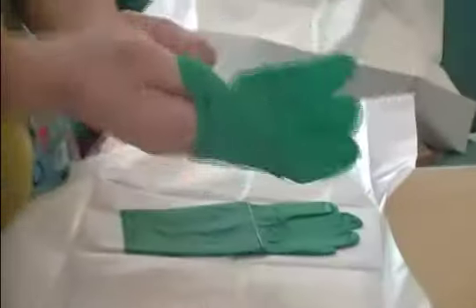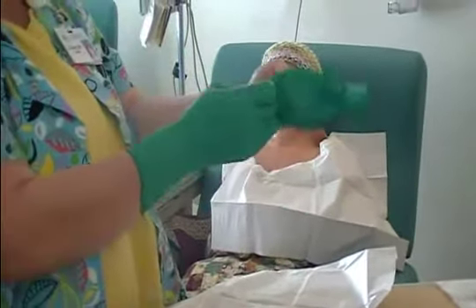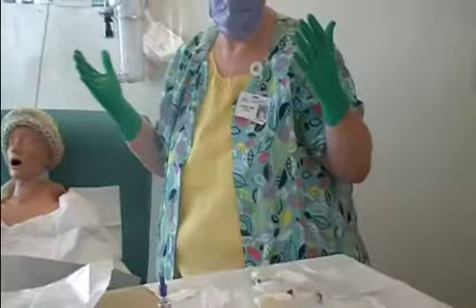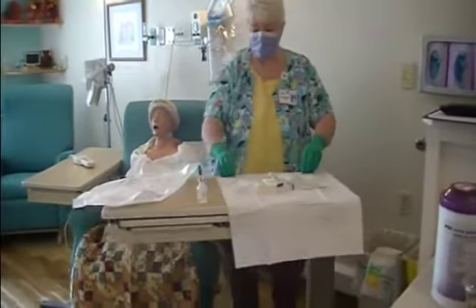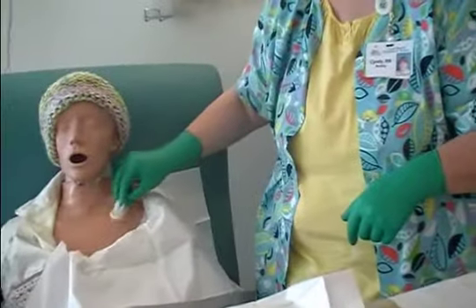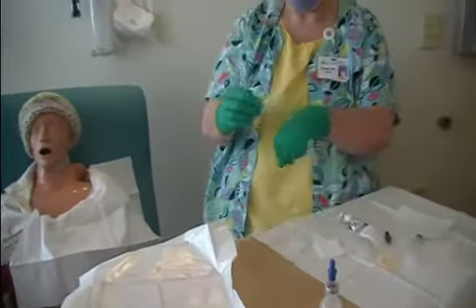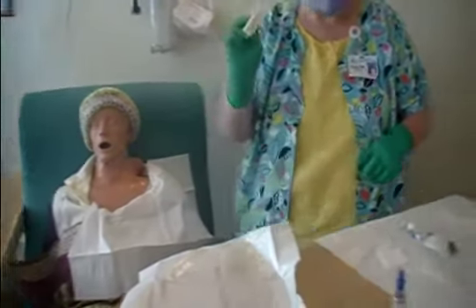I have my safety needle — it is a non-coring safety needle. We try to use the 1-inch 20-gauge; sometimes we only have the 1.5-inch available. If it sticks up too much out of the chest, you're going to want to support it a little bit. Now I have my sterile gloves on, and I'm going to start prepping. You start over the port and you work your way out, away from it.